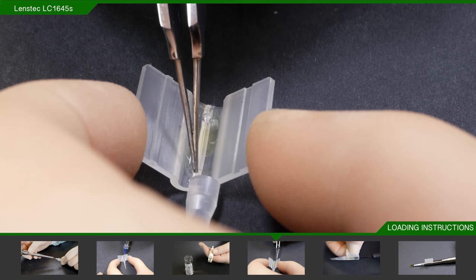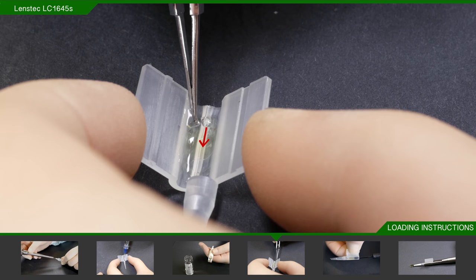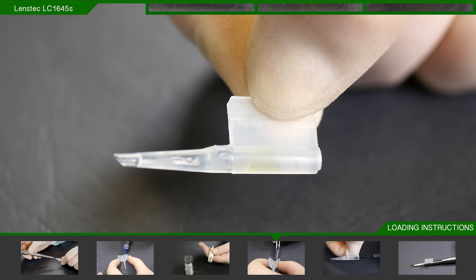Being careful not to let the flaps open again, use your forceps to manipulate the tip of the leading haptic back towards the optic and create a closed loop. Then repeat the process with the trailing haptic. Once you are happy that your haptics are in the right place, advance the lens toward the front of the loading chamber.